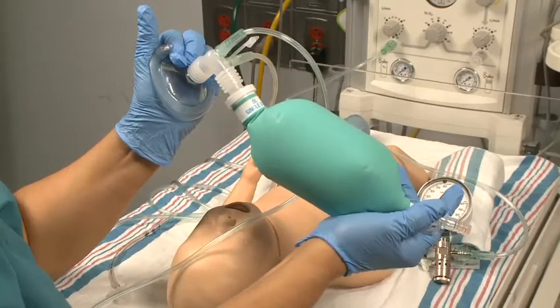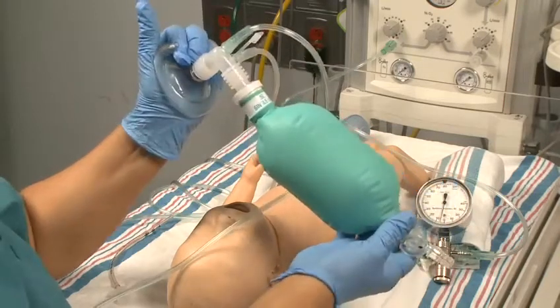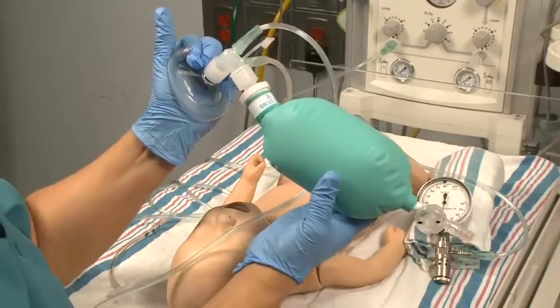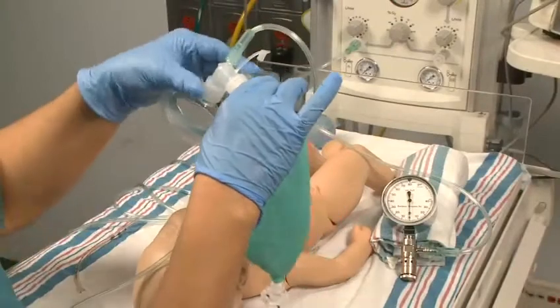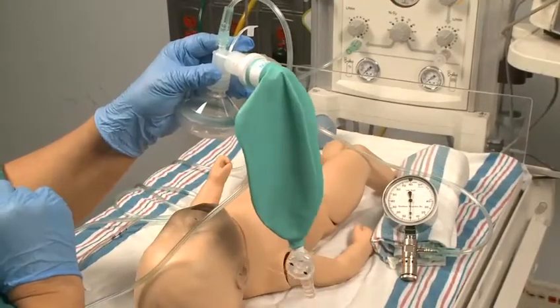A flow inflating bag fills only when the gas from a compressed source flows into it. The flow inflating bag is collapsed like a deflated balloon when not in use.